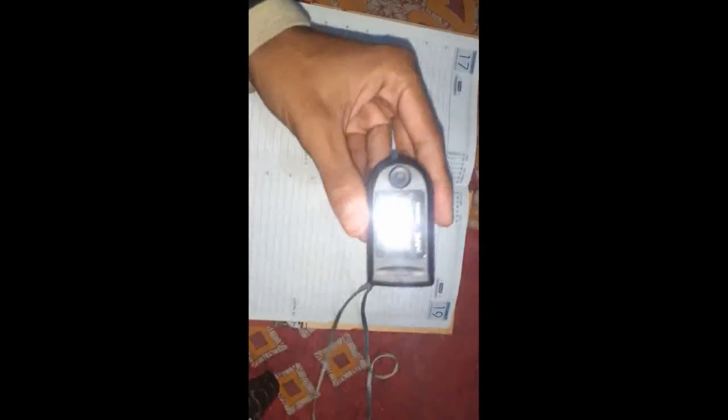How can we measure pulse oximetry? With the help of a device, pulse oximeter, we can measure the pulse oximetry. This is the device, this is known as the pulse oximeter as you see it.